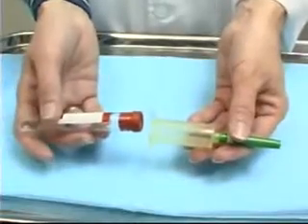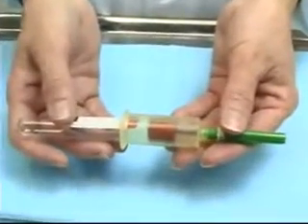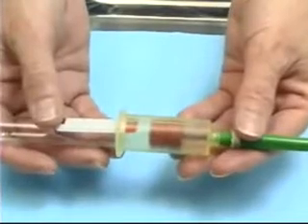I'm going to rest the blood collection tube inside the vacutainer holder, just abutting the end of the tube to the needle.